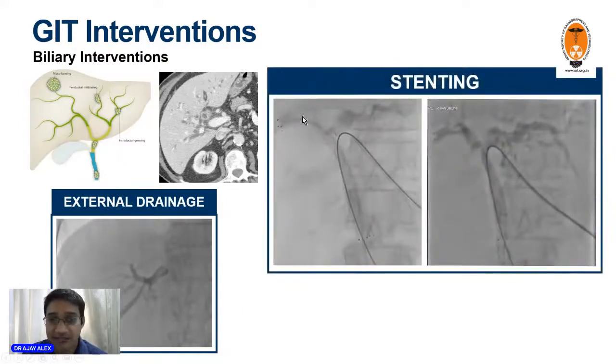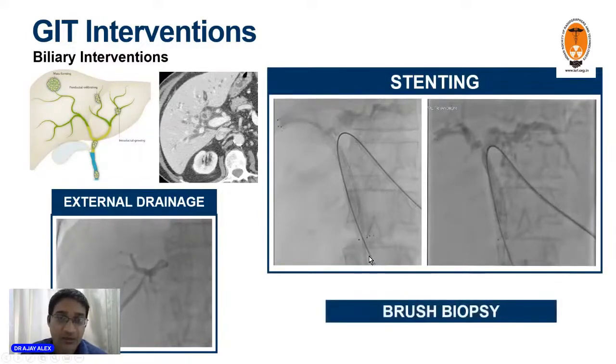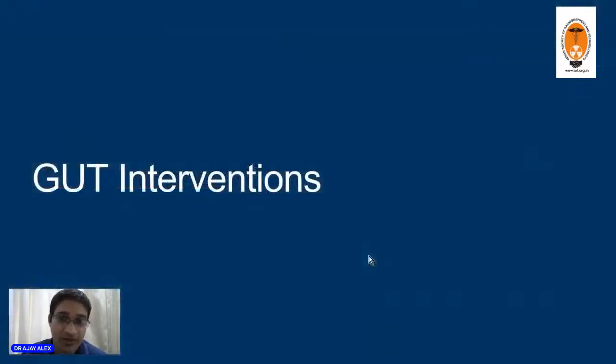Or further, we can actually stent the segment of the tumor so that bile will normally flow into the alimentary canal. The result being that you can help the patient get adequate dose of chemotherapy, improving the quality of life as well as overall survival.